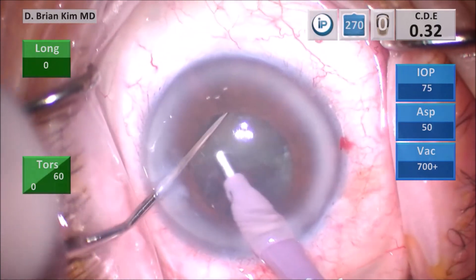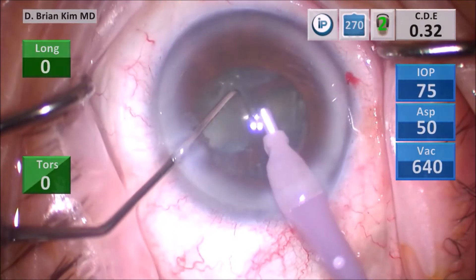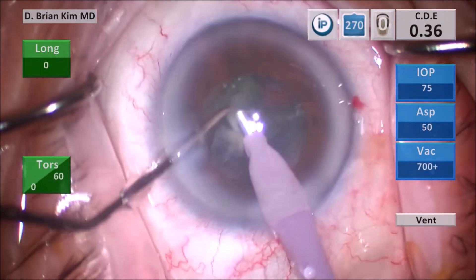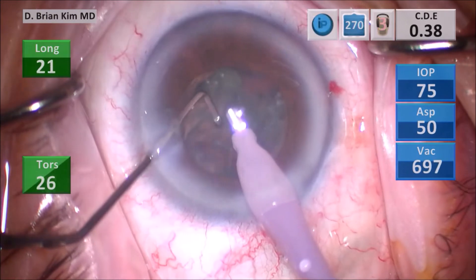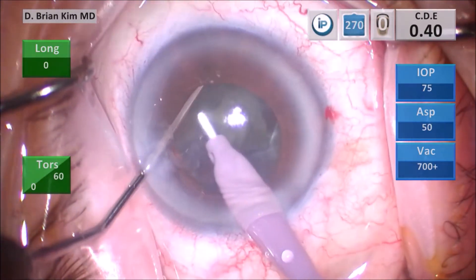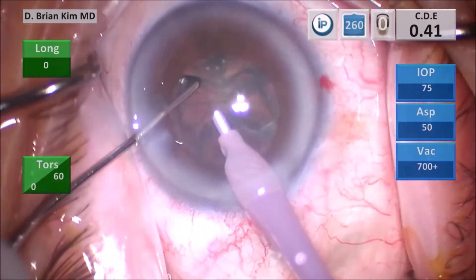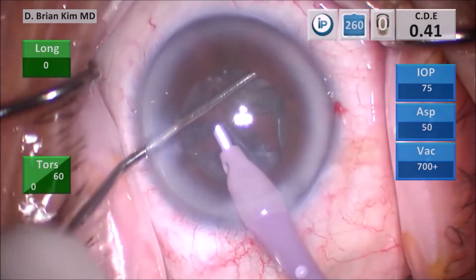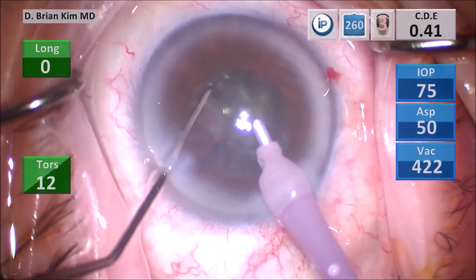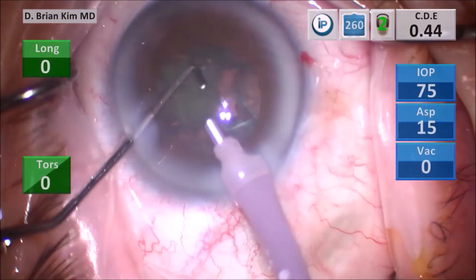I turn the second hemi-nucleus in front of me, place the chopper out to the equator, and crush the girth of the lens piece between the chopper and the phaco tip, dividing the third and fourth quadrant. I pull out that third quadrant with the chopper and crush the lens pieces into smaller pieces using intermittent bursts of phaco energy as well as vacuum. With the last quadrant, I place the chopper out to the equator again, crush the lens pieces into smaller pieces, and carefully emulsify them.